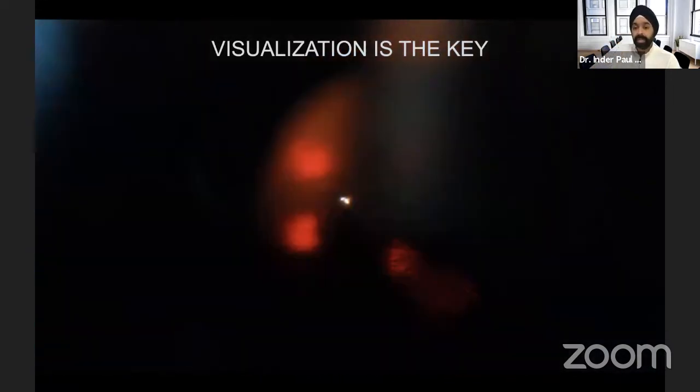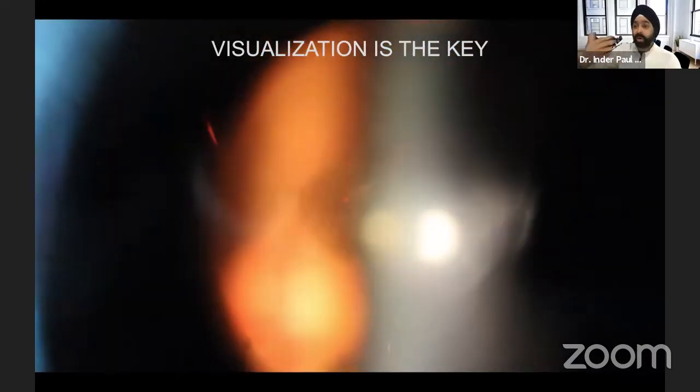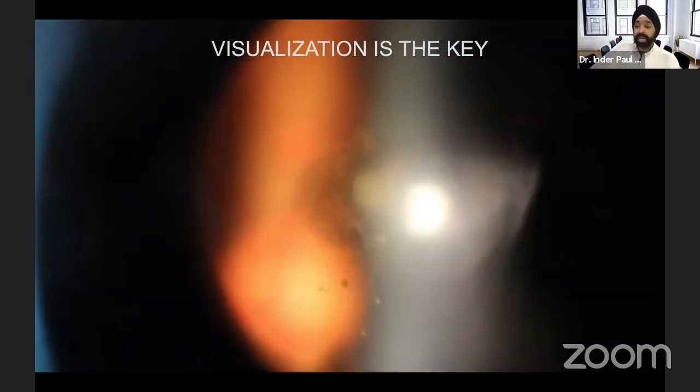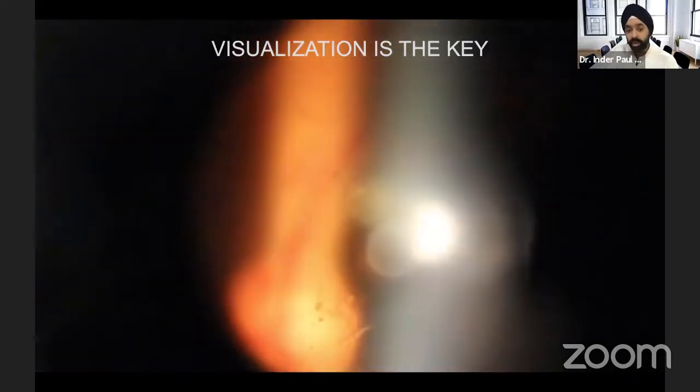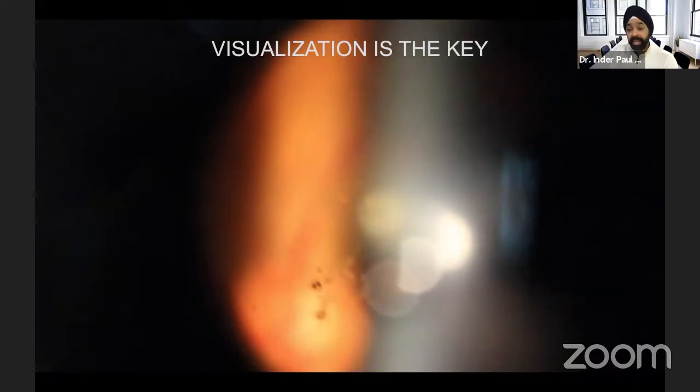One of the most, I think, common misunderstandings and misperceptions is that we're just breaking things up. Yes, we are fractionating, we're breaking, but we're also vaporizing. So we do not stop at 20, 30 shots like a YAG capsulotomy. We keep going until visually we do not see any more of those small opacities remaining. So we break and vaporize, break and vaporize, because plasma is the fourth state of matter, solid to gaseous state. So you're creating small areas, microns of vaporization, which is why we have to do 200 or 300 shots oftentimes, if not more, to vaporize.